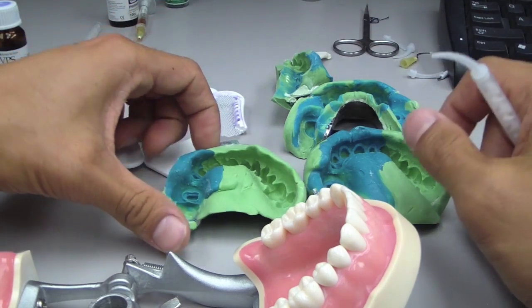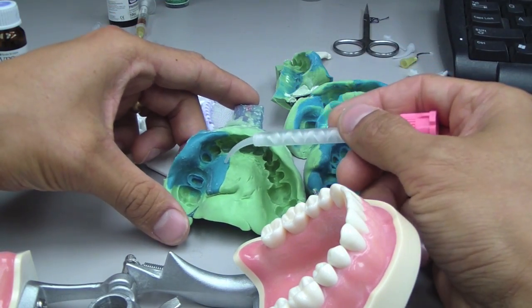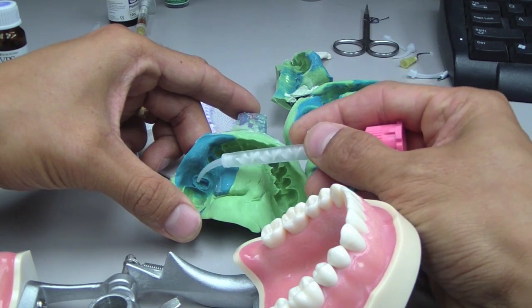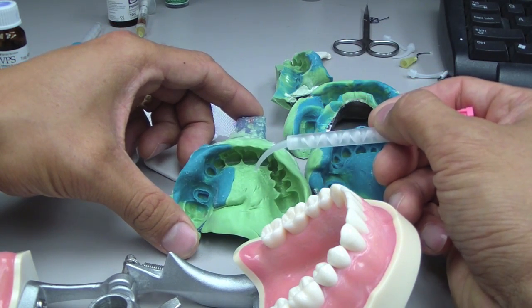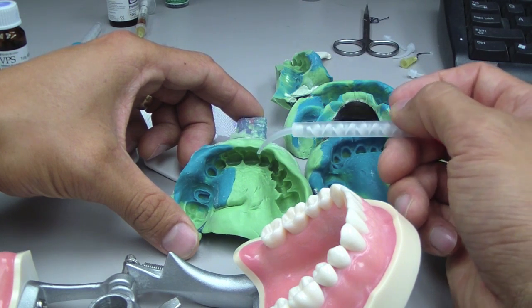The second important concept is the viscosity of the impression material that you're using. We're doing a dual phase technique where it's a low-viscosity material to flow around the abutments, followed up by a heavy or medium-heavy body material.